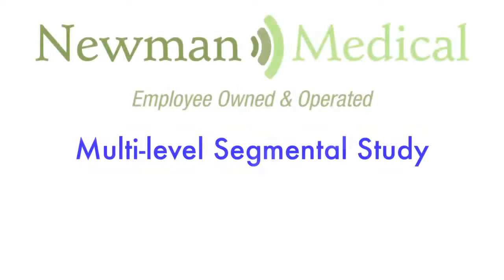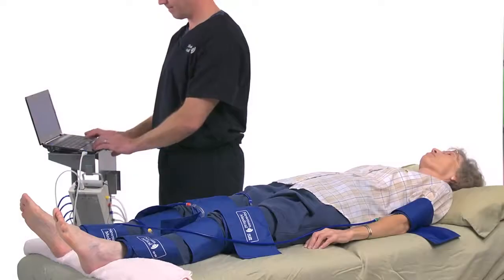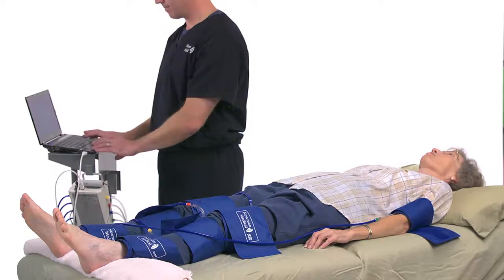The segmental exam is more officially known as the Complete Bilateral Physiological Study. This test is an extension of the single-level ABI exam to include diagnosis at the calf and thigh. This exam allows you to determine the region of the disease. Have the patient lie down in the supine position, relaxed with head and heels supported in a comfortably warm room.